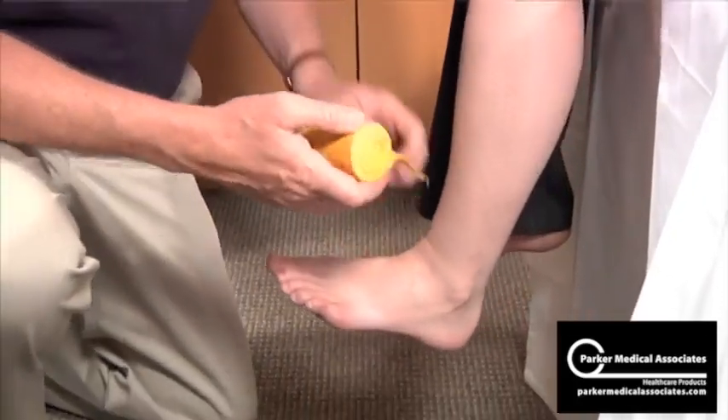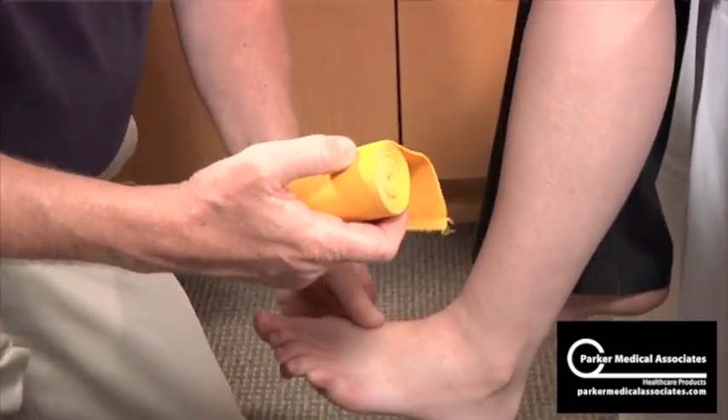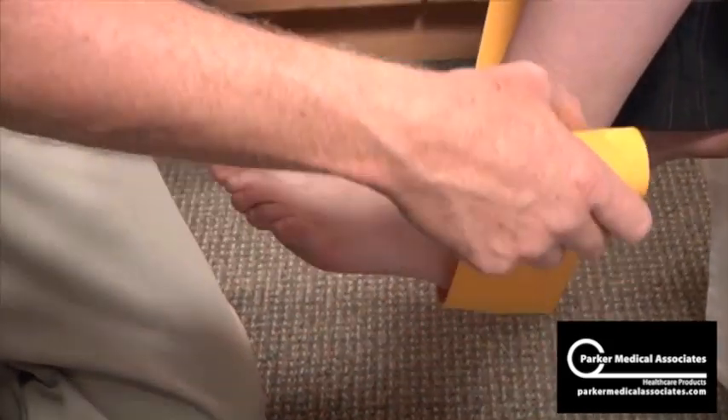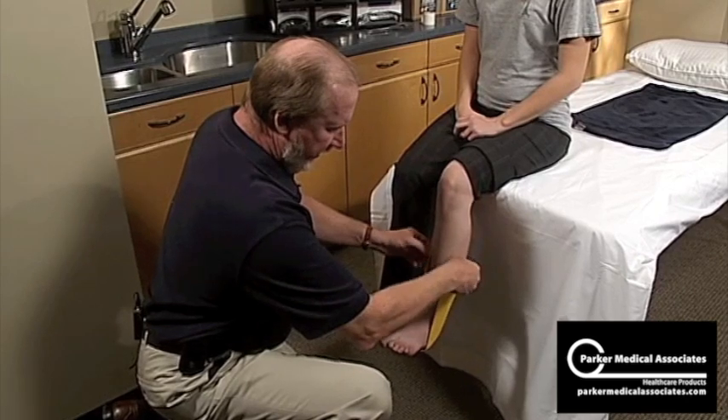Your measurement will be determined with a three-inch elastic bandage. All I have to do is come underneath the heel, come up on both sides about mid-calf, and that's my measurement.